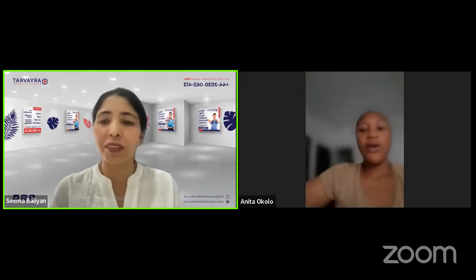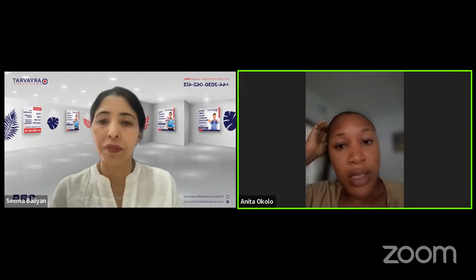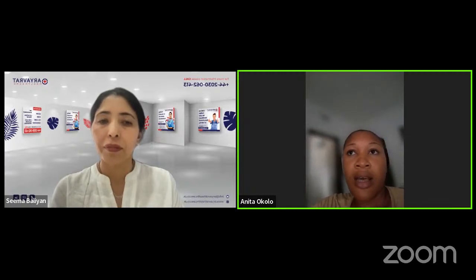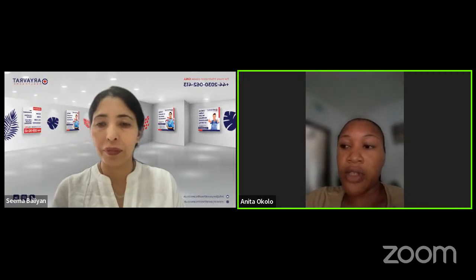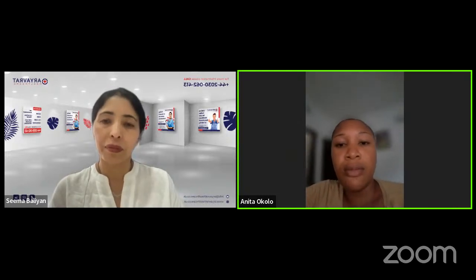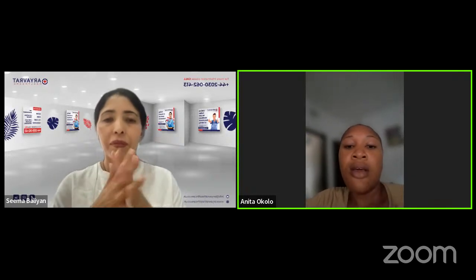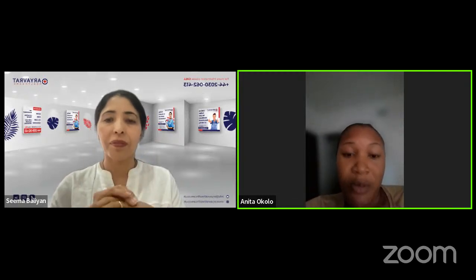So I'm entering into my patient's room and ensuring everywhere is safe. I'll greet my patient. Good afternoon, Mrs. Ash Potter. I'm Nurse Anita, and I'll be attending to you today throughout my shift. I'll proceed to carry out my hand hygiene with the hand sanitizer, and I'll start by doing my palm to palm, fingers interlaced, fingers interlocked, back of palm to back of palm.